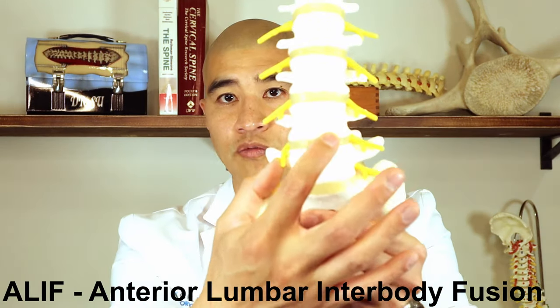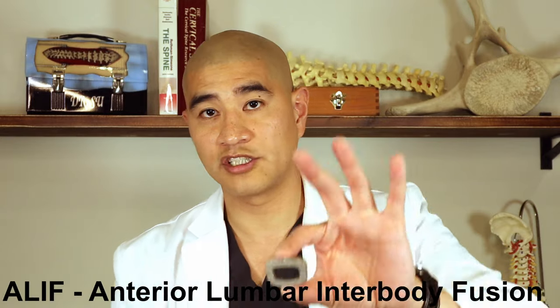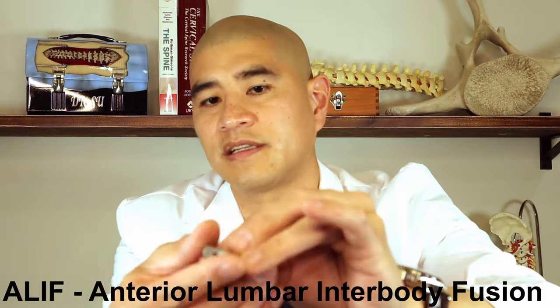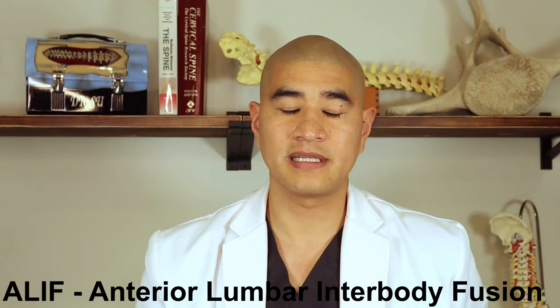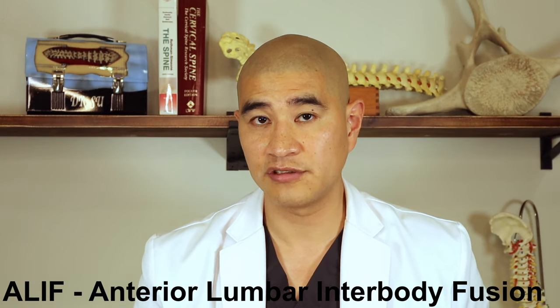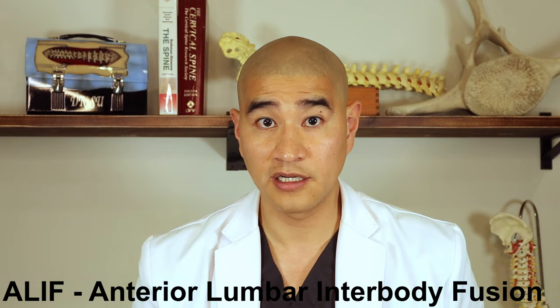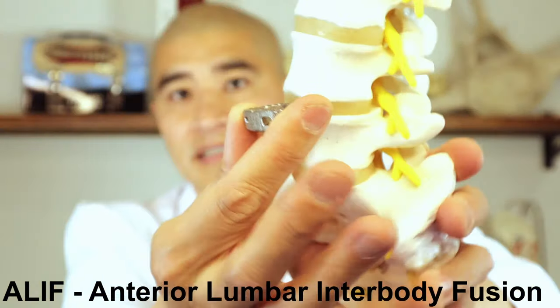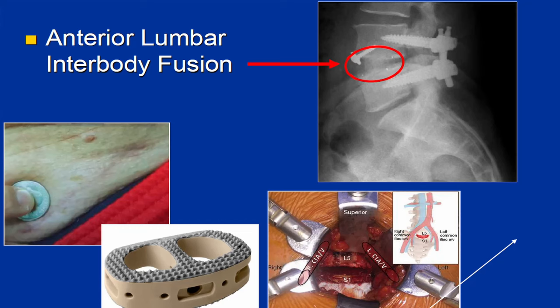Once we expose the disc from the front, we take it out in entirety and place a cage — usually a quite large cage for ALIF. The cage has a hole in it filled with a bone-growing substance called BMP, which is very powerful. At the low doses we use, there are no significant safety concerns, and the fusion rate is almost 100%. Here you can see an x-ray of the cage in place, with screws in the back supplementing as well. That's the ALIF — anterior lumbar interbody fusion.